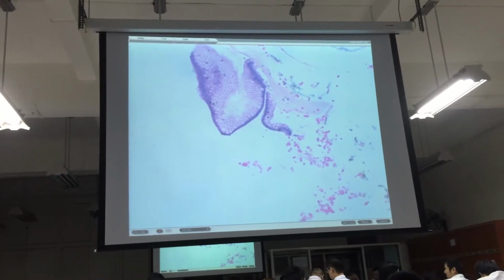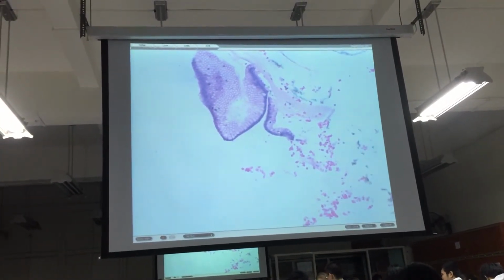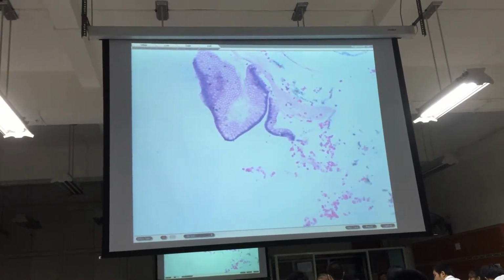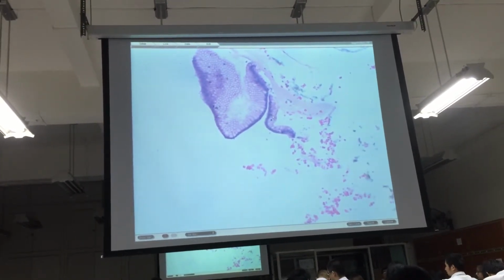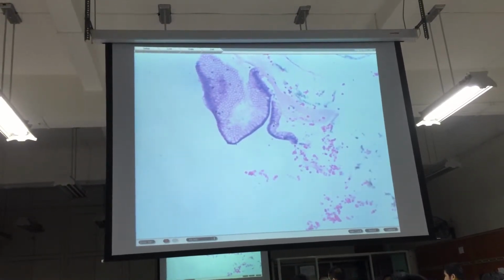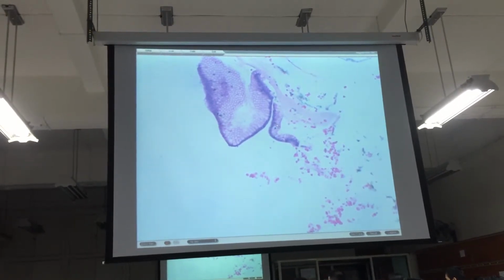And this is okay. It has stages. The next stage of mucinous cyst adenoma is there's stratification of your nuclei. You call this now your borderline mucinous tumor or low malignant potential. Mucinous cyst of low malignant potential.